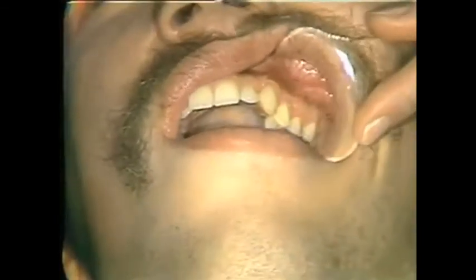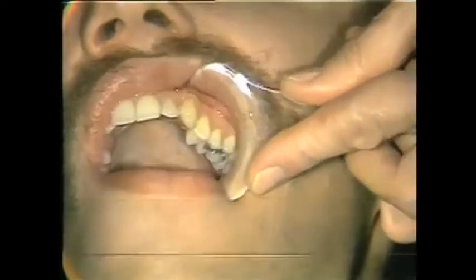All right, let's see if we can't show it nicely here on the patient. Again, we're using a retractor, which normally isn't necessary, just so you can see a little bit better. First we'll dry our mucosa, and you might close just a tiny bit. At the same time, I'm palpating the malar strut. I know where it is, about here at the second molar. And then we'll use a little betadine again, as usual, in our injection site, well out in the vestibule this time.